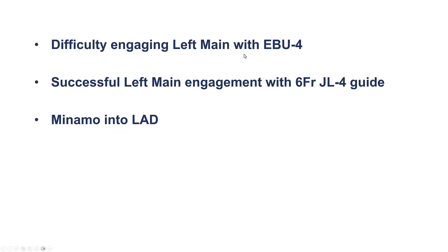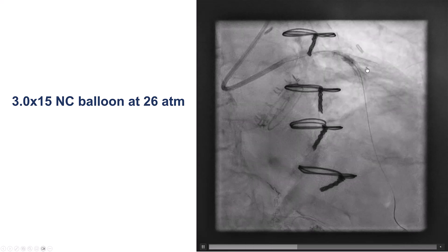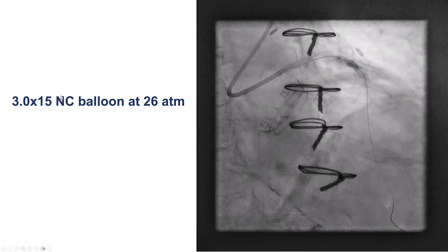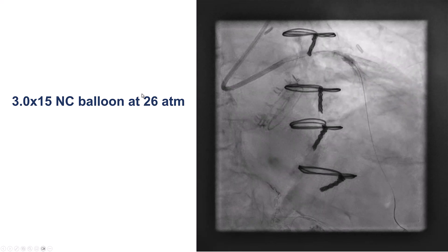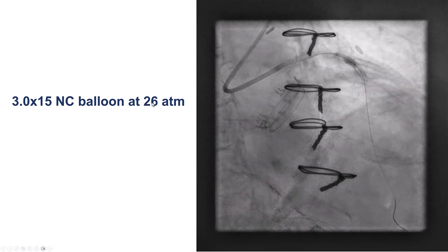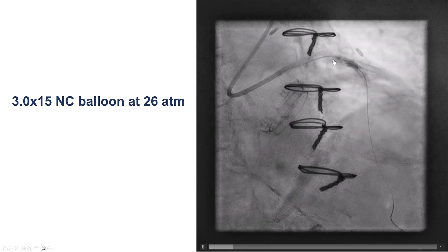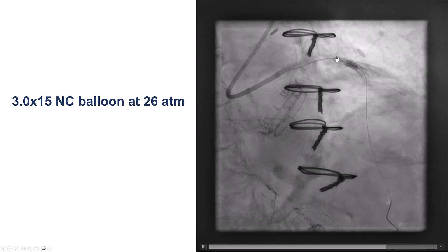We had some difficulty with engagement. Eventually, we used a JL4 in exchange for an EBU. We tried to predilate with a non-compliant balloon, inflated at fairly high pressures at 26 atmospheres. However, there was still a waist within the balloon.